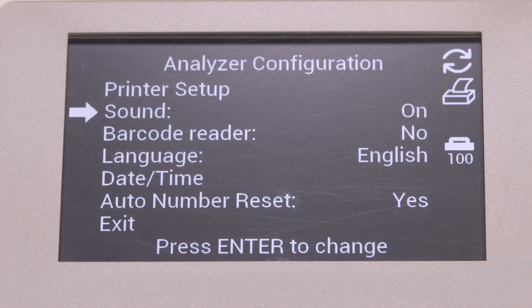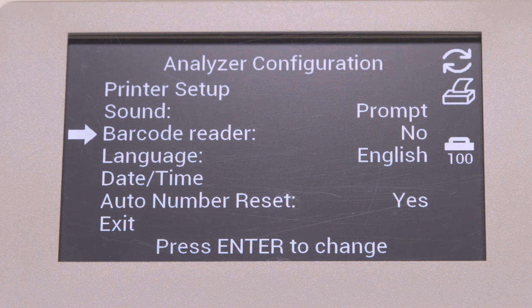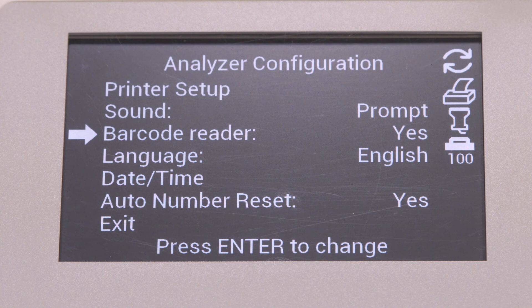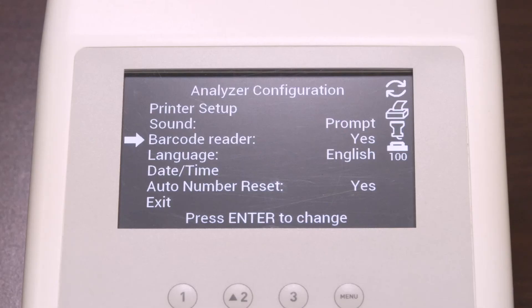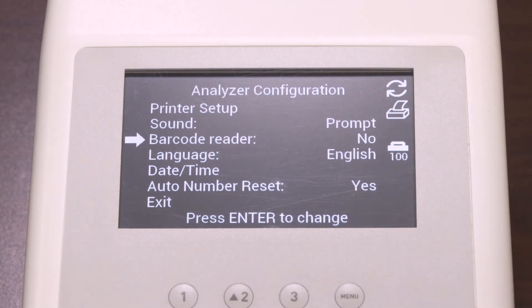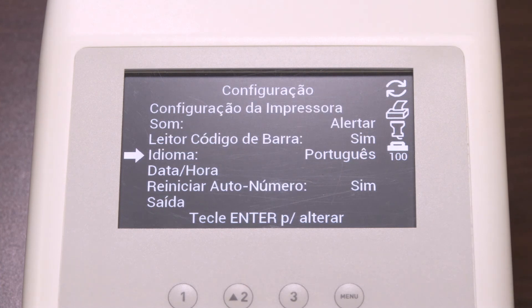You also have the ability to use a barcode reader. Select the barcode reader and press enter to cycle between yes or no. Yes displays a prompt for full usage of the barcode reader, and the barcode reader icon will be shown. The barcode reader needs to be set to yes in order to manually enter patient ID numbers at the time of the test; the analyzer will prompt you to enter the patient ID using the numeral keys. If the optional barcode reader is not present and you do not use patient ID numbers, this setting can be set to no.